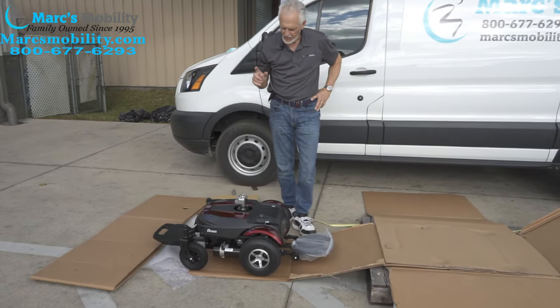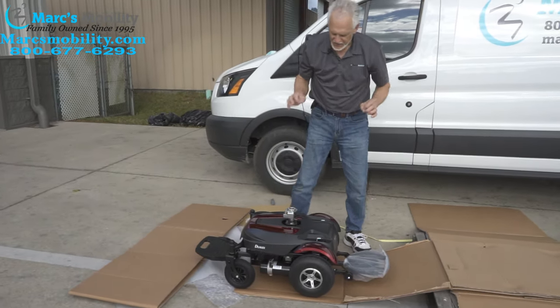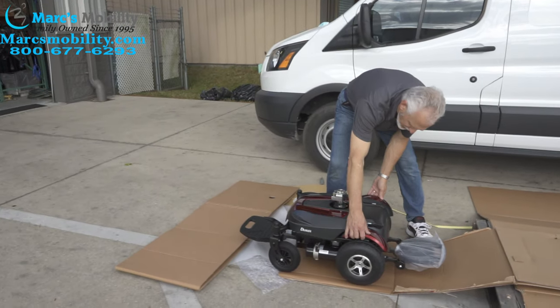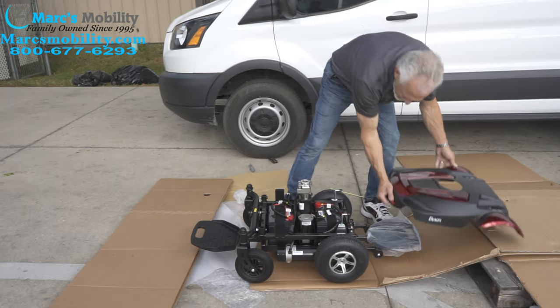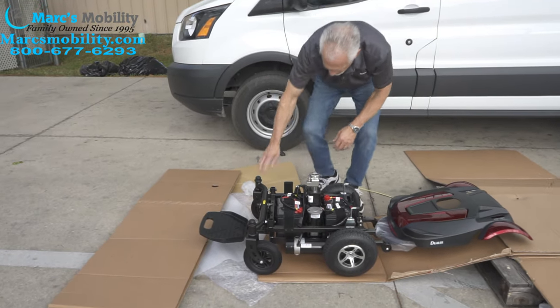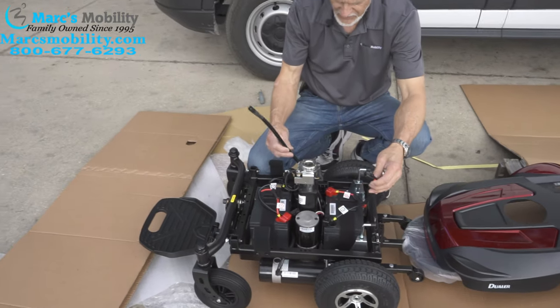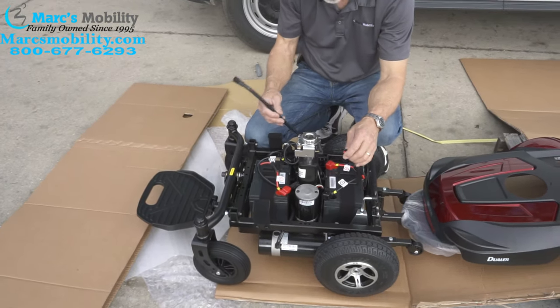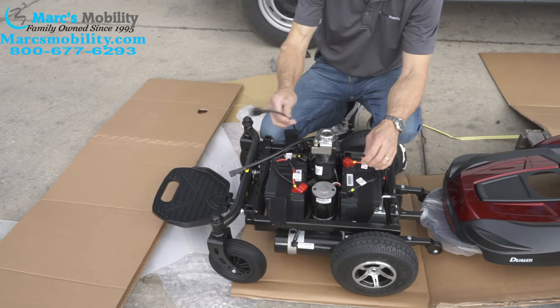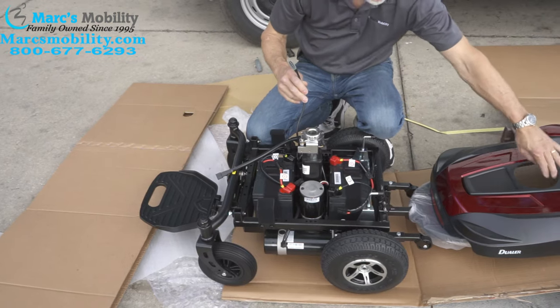The next thing you're going to do, before you put your seat on and finish it all up, you want to make sure the batteries are connected. We're going to pull this cover off — this cover pulls right off. If you look inside, you can see the batteries are not connected. You also have your cable right here for your joystick, and that cable has to come through that hole right here.